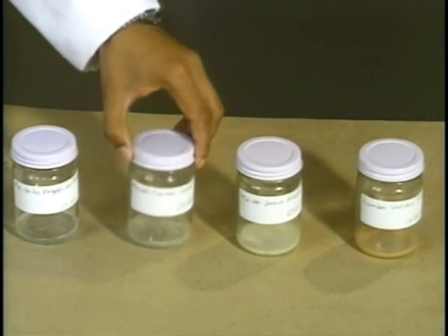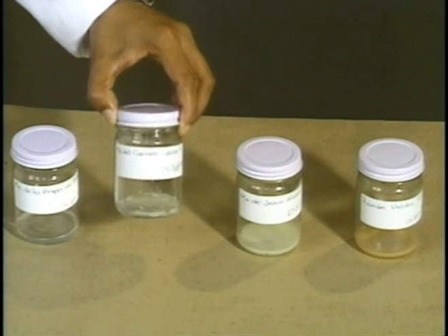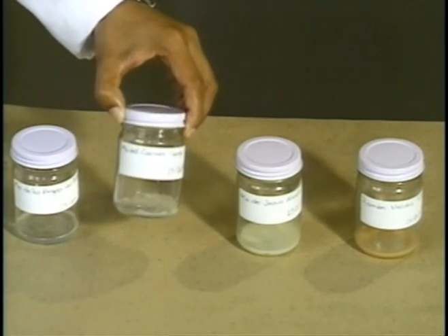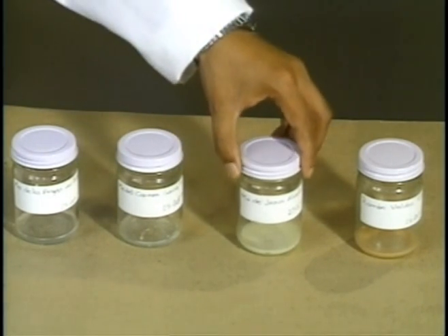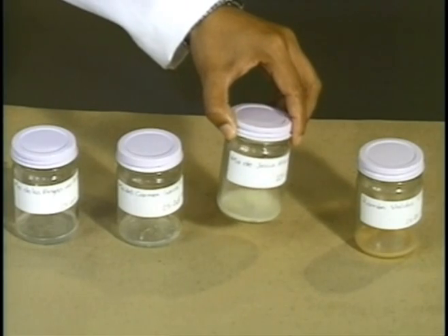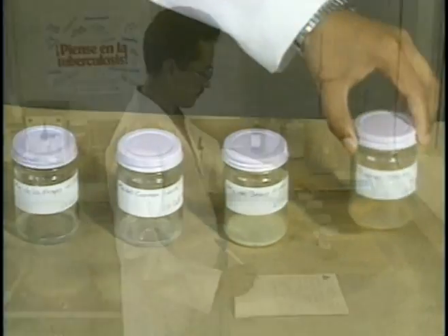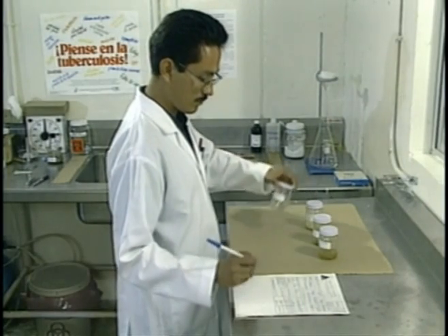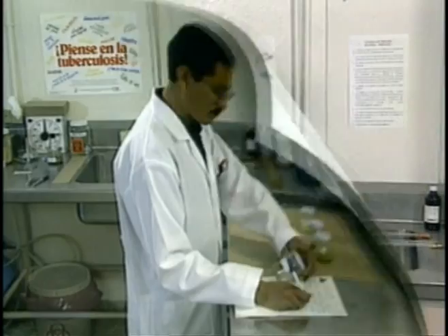A good sputum specimen should be 3 to 5 milliliters in quantity. It is frequently thick and mucoid, but may be fluid with chunks of dead tissue. The color may range from opaque white to green. Bloody specimens will be reddish or brown in color. Record the visual appearance of the sputum sample on the lab form.